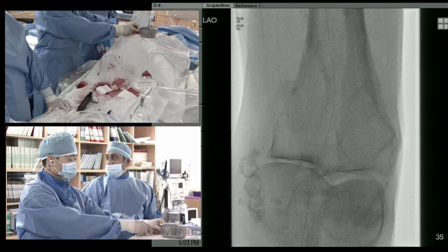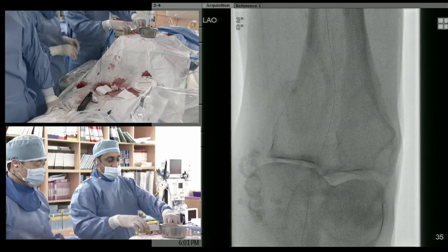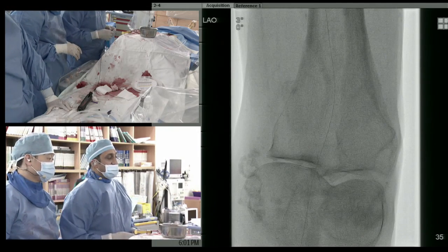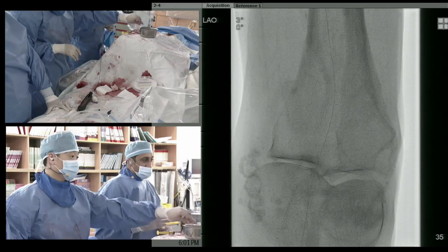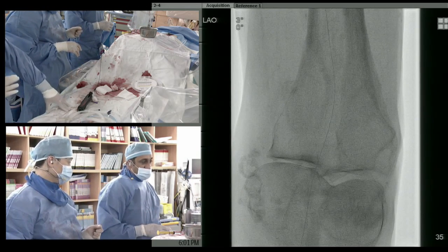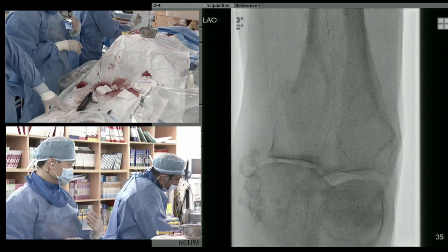So Rajesh, we're running out of time here. Give us a summary of how you plan to move ahead with this case and give us an excellent result. Sure. I think we're almost there. I just need to be completely sure that we're in true lumen, and I'm pretty sure we are, because the worst thing to do would be to do an atherectomy in the false lumen.